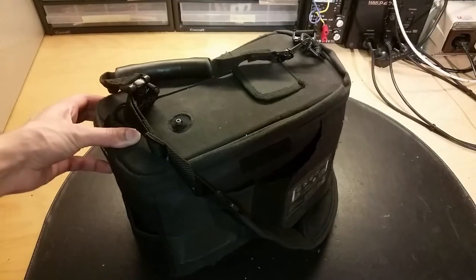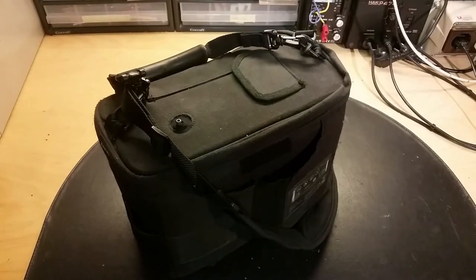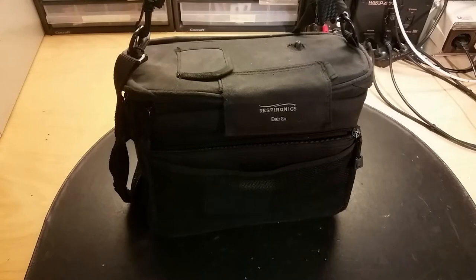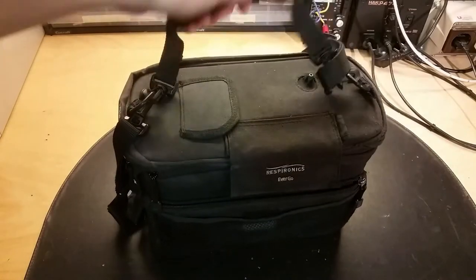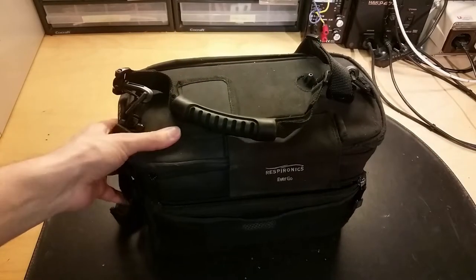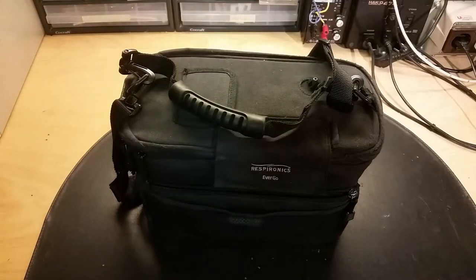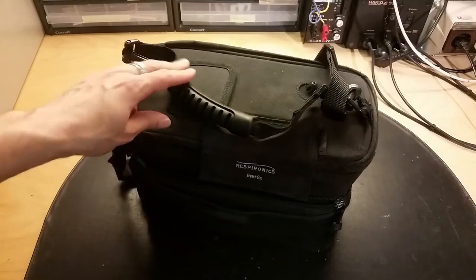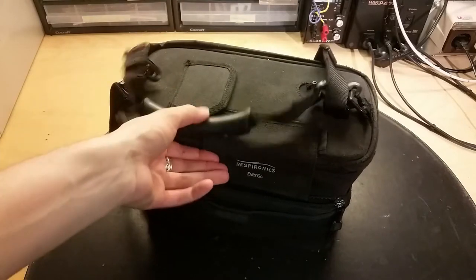Let's have a look at this small portable oxygen concentrator. It's quite a small unit - it's a Respironics Evergo. The special thing about this unit is that it's approved to be on aircraft and helicopters. This unit was actually used in the helicopter here.